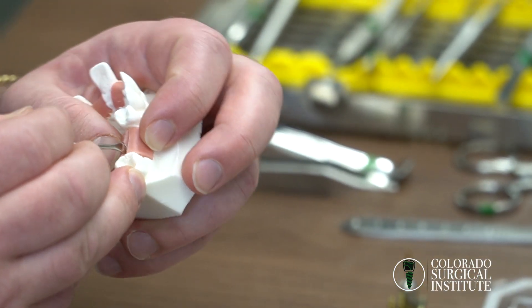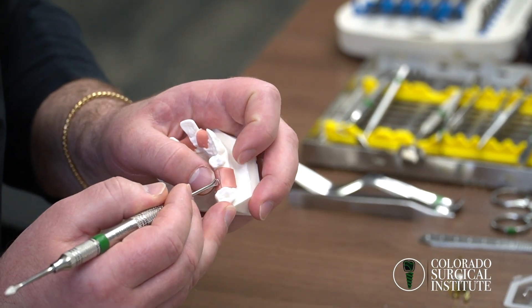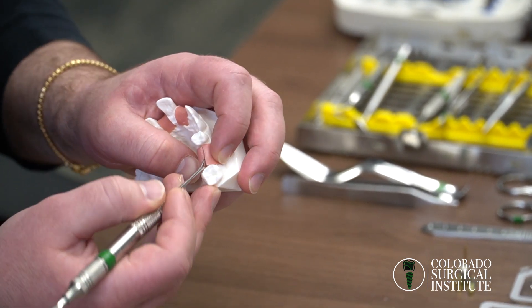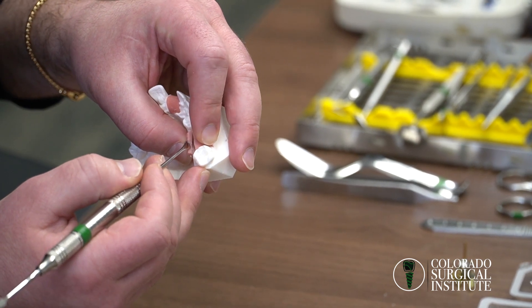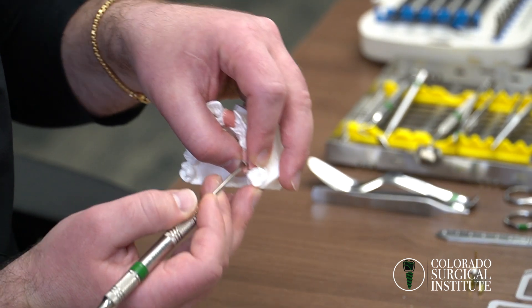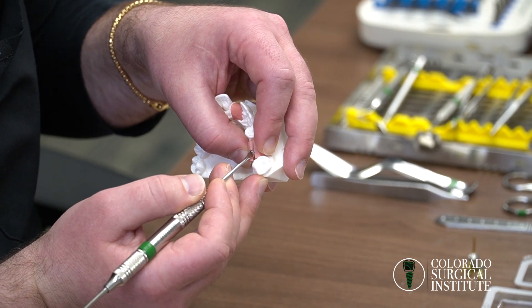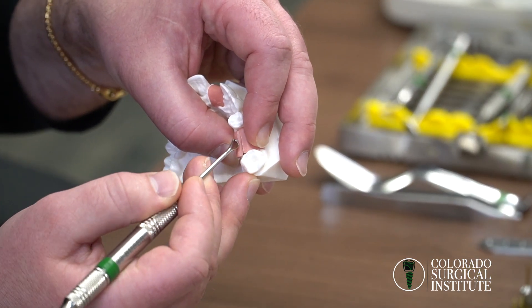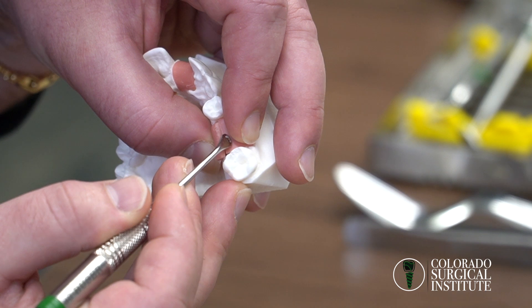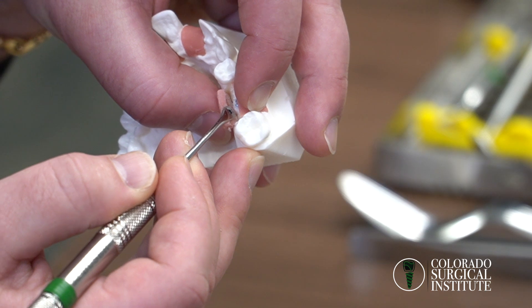Once you place the implant, if you peel back the lingual tissue, you'll see it lies on the lingual side. If you peel back the lingual tissue, you'll see how the buccal tissue goes over the top of the implant — about three-fourths, almost 80% of the implant is covered with tissue. The reason for the slightly lingualized incision is to have more buccal tissue covering the implant.